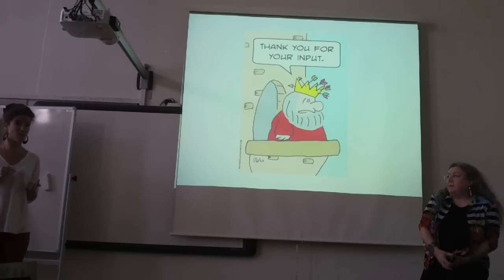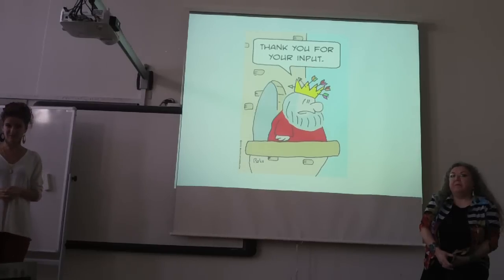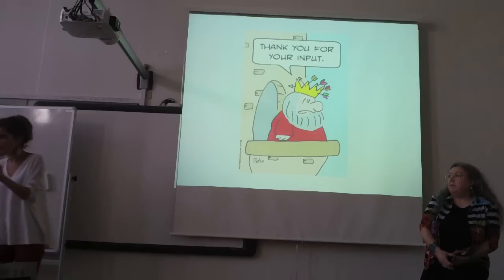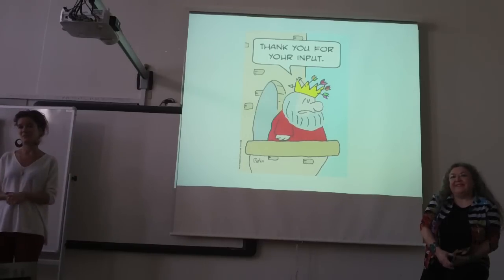But there had to be agreement with everybody. So I have also sent these examples to authorized teachers and trainees, and they had to agree on the fact that, okay, I would say this is flageolet too. So it was all based on sound, all the flageolet samples, not on image. Not like, I want to see this image, can you produce this? No, just sound, and then we looked at what was happening.